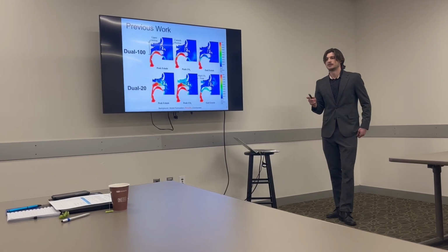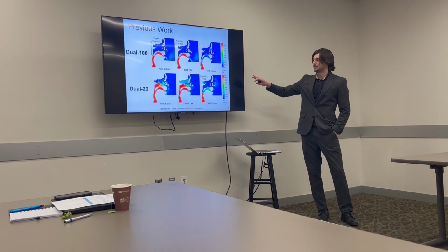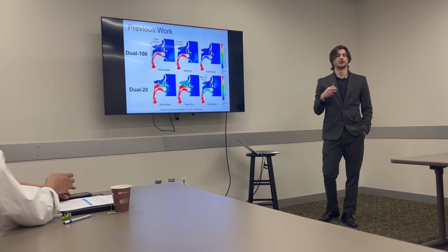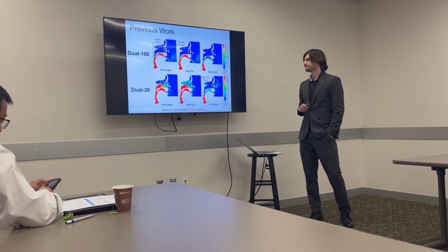And then end exhale is the moment just before the inspiratory phase starts. And we care a lot about that timestamp because that's giving us a snapshot of how much CO2 is available for rebreathing. So we want to minimize the amount of CO2 at end exhale.